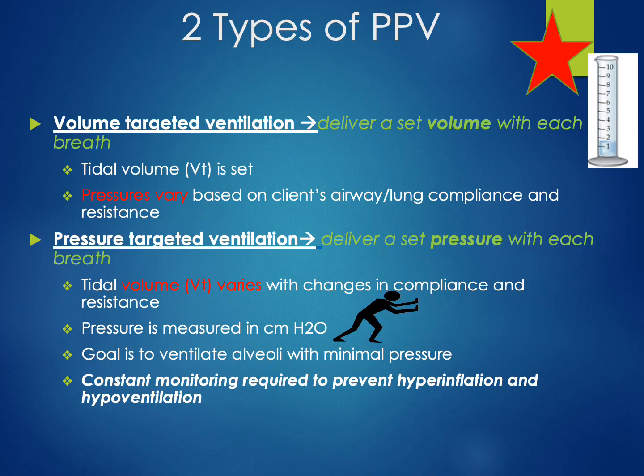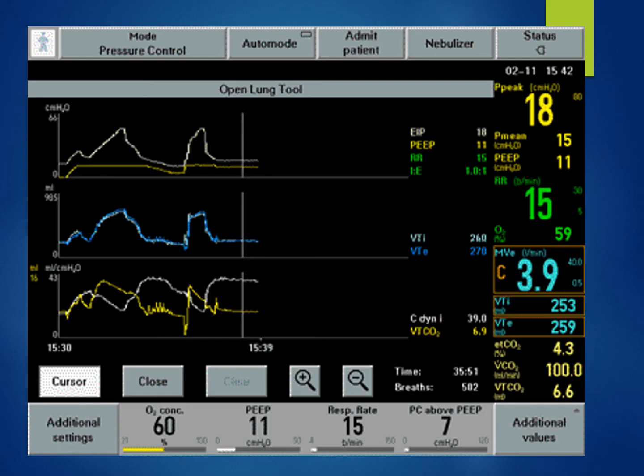So we've established that a ventilator will be programmed to deliver a set pressure or a set volume. Well, let's look at one of these intimidating ventilator screens. There's a lot of numbers here and waveforms and letters, and in the ICU sometimes these numbers are constantly changing and flickering and others are not changing. However, you can already identify a few familiar words and numbers here.